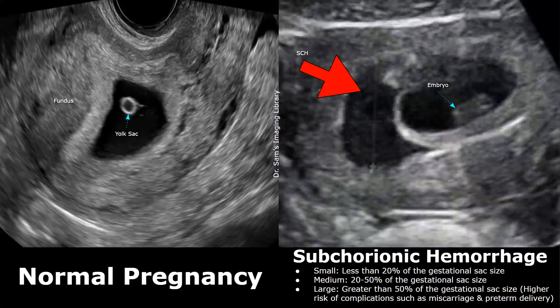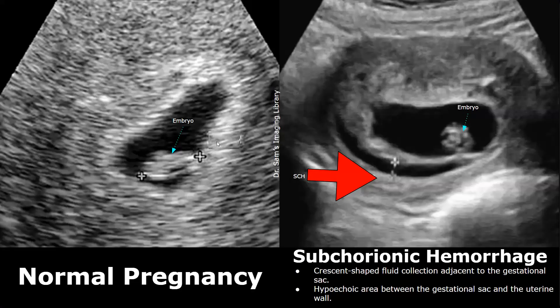This is another large hemorrhage. It is greater than 50% of the gestational sac size and carries a higher risk of complications. In the normal image on the left, you can see a smooth gestational sac with no hypoechoic fluid collection next to it. In the image on the right, a crescent-shaped hypoechoic fluid collection is seen near the gestational sac — this is the subchorionic hemorrhage.